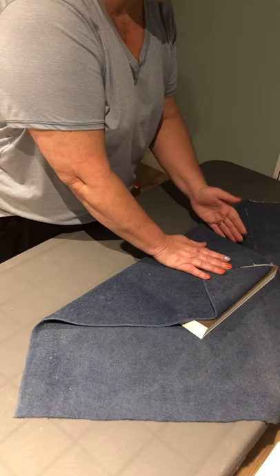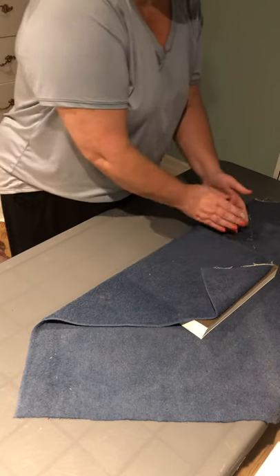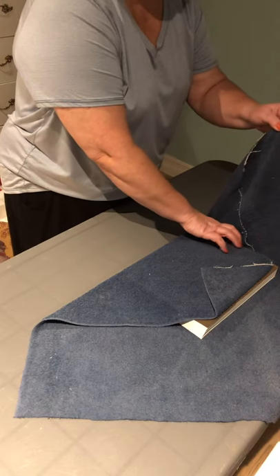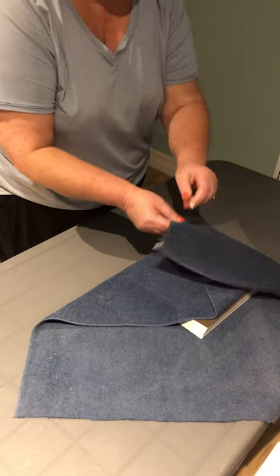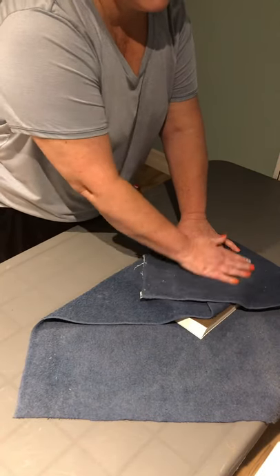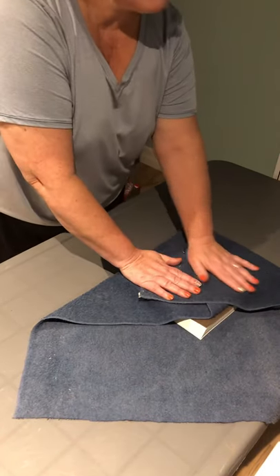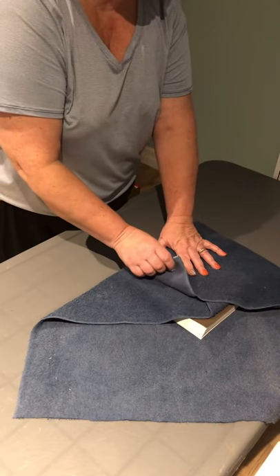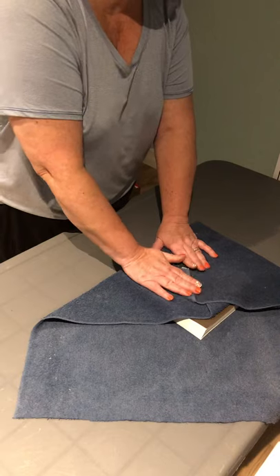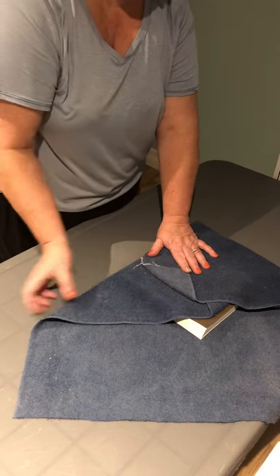I will then press down the material against the package while folding the left corner up and over the package. I will fold a small tab by folding the tip back.